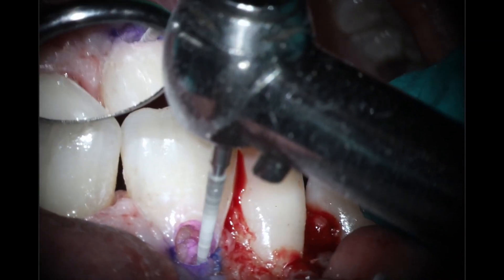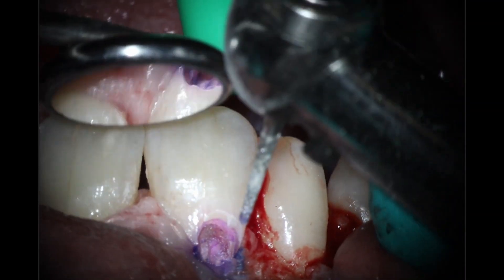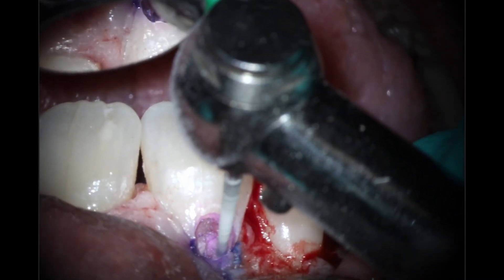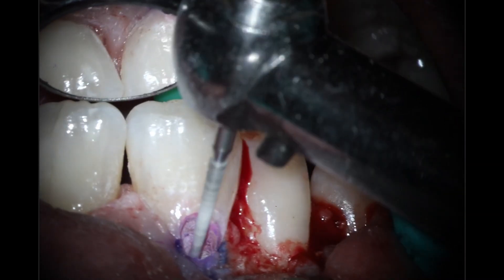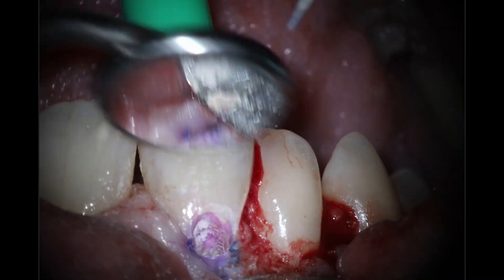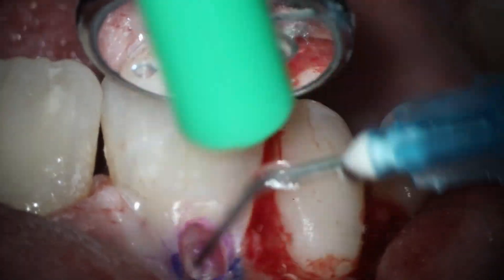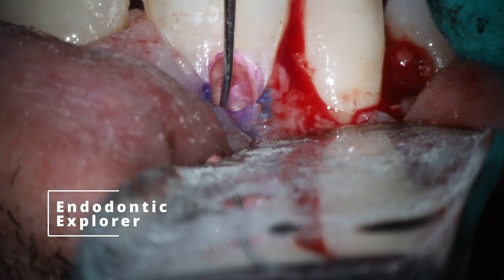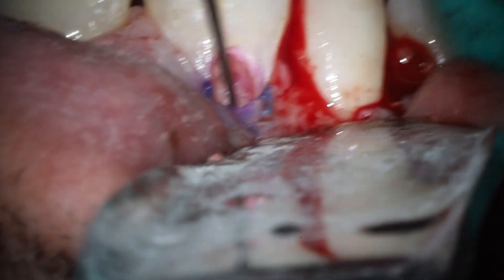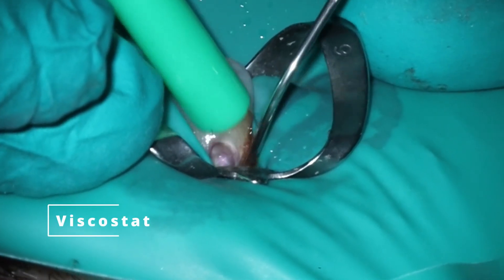I'm kind of flipping between views — sorry, this one isn't stabilized, but I wanted to show you the very awkward angle to go inside there. You almost have to look, brush a little bit, look, brush a little bit more, because the other option is just taking away so much tooth structure. You're going to really damage it. This is his front tooth — he's a nice young guy and never had any symptoms at all. So if I'm going to convince him to do treatment, I have to make sure the result is as good as it can be. Looking inside going in one more time — you can actually use the endo explorer just to feel if there's any spots where it dips in. We're really far down there, but it did feel nice and solid.